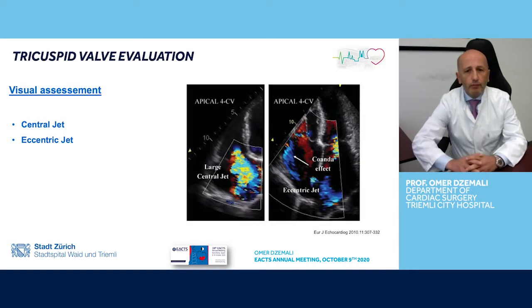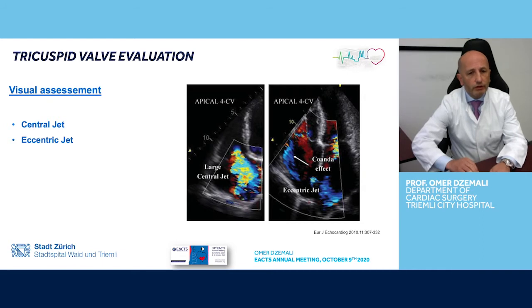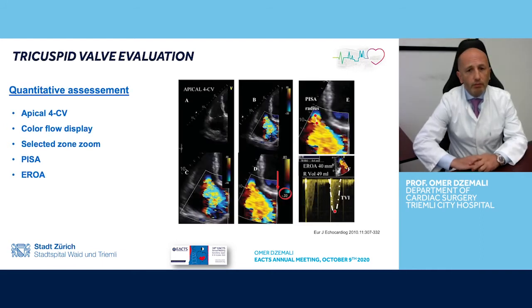The algorithm for relating color flow area parameters to tricuspid regurgitation severity is less well developed. The color flow area of the regurgitant jet is not recommended to quantify the severity of tricuspid regurgitation. Color flow imaging should only be used for diagnosing tricuspid regurgitation. When feasible, the PISA method is reasonable to quantify the tricuspid regurgitation severity.